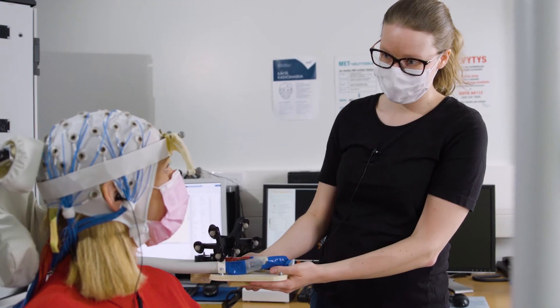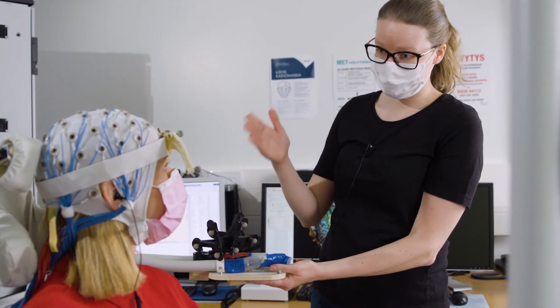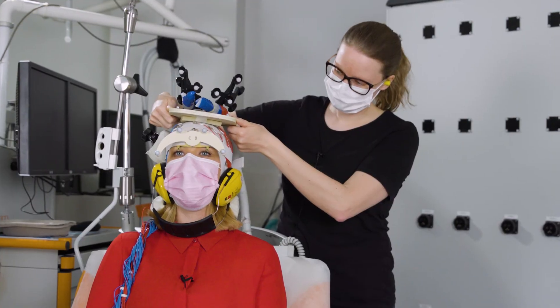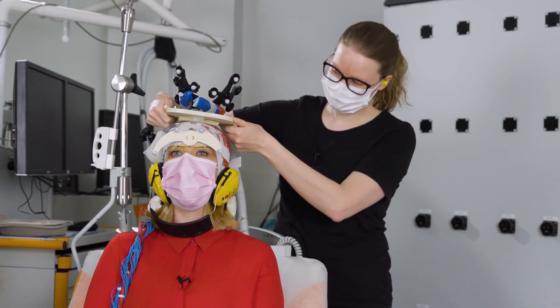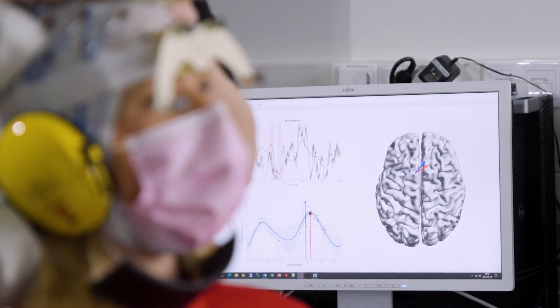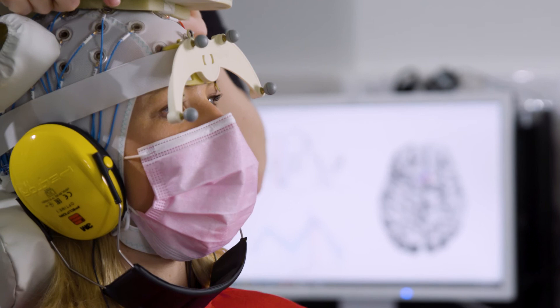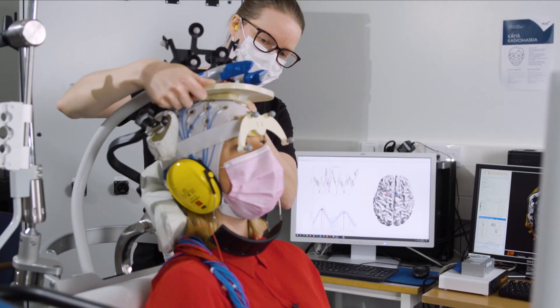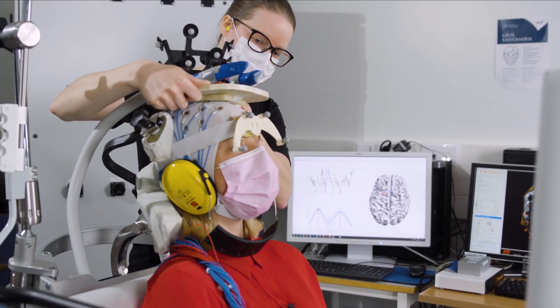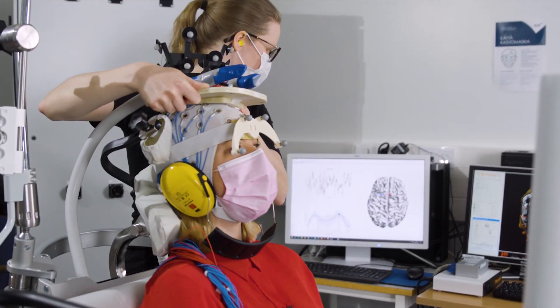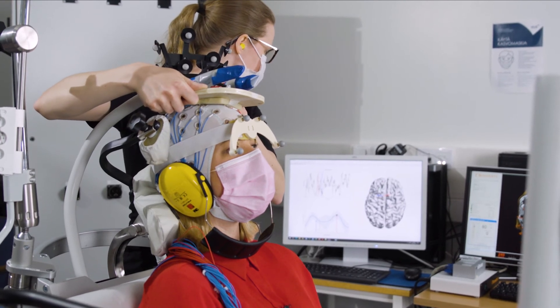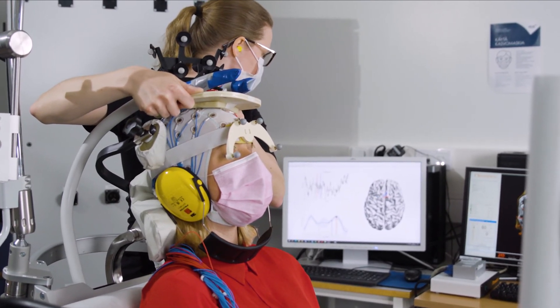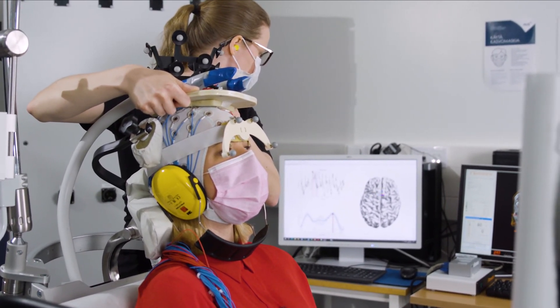What we do is automatically give pulses in different orientations, and then we adjust the orientations based on the brain signals we record, as we are automatically trying to find the most suitable stimulation orientation.